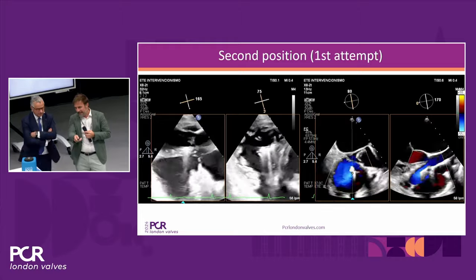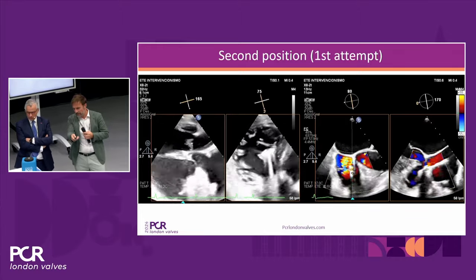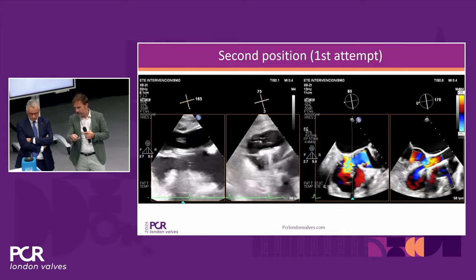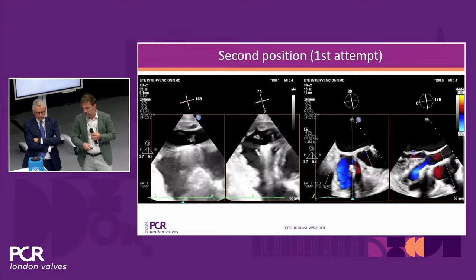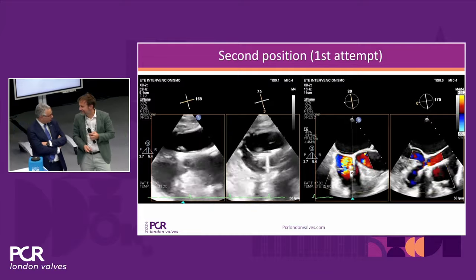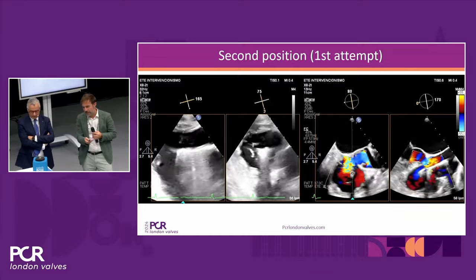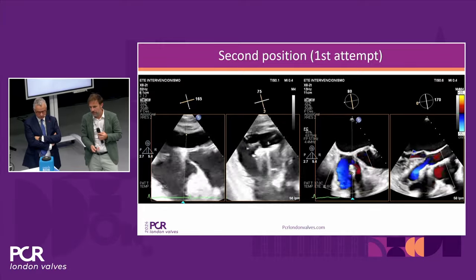That's right. Okay. And indeed, this transgastric view is really beautiful because you can see that our catheter now is behind the papillary muscle. So we are working septal and lateral, but this lateral leaflet probably is the posterior, the one with the flail. So we are working there. It was kind of a surprise because we were thinking it was an anterior, but it was part of the posterior. That's very right. Good. So as Pedro described, it's just in the middle, just over the papillary muscle, that the patient got the rupture.